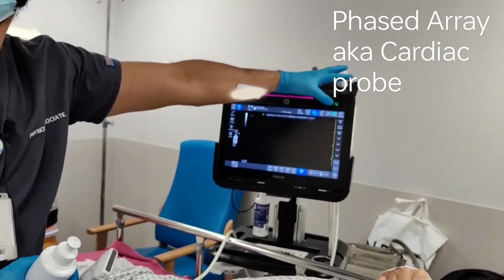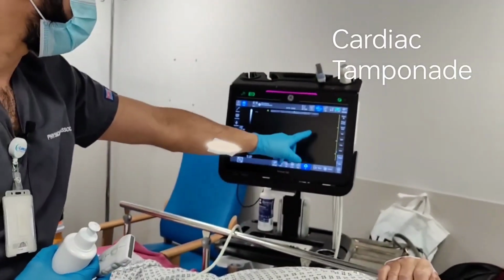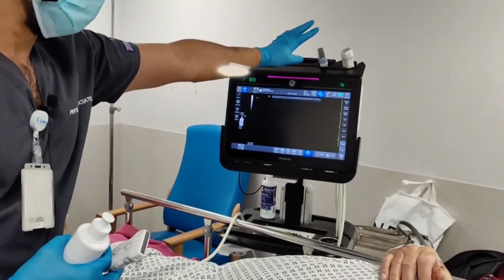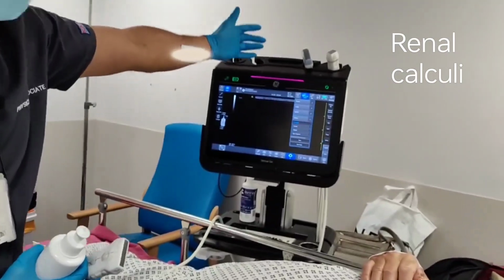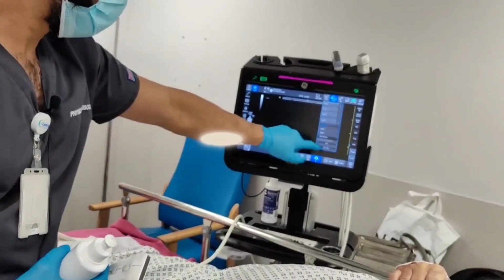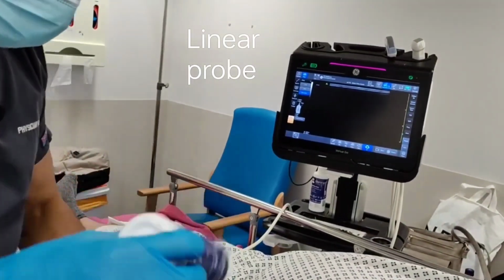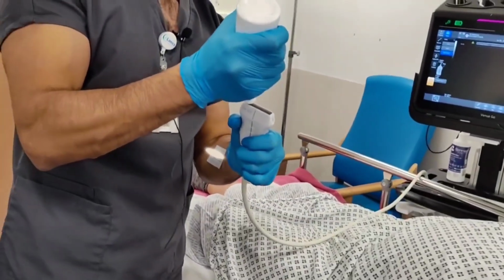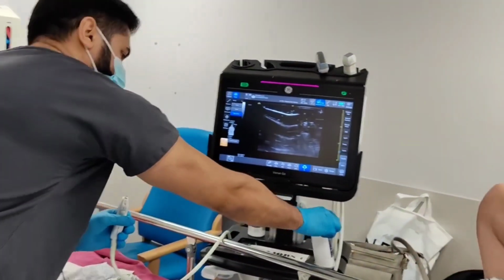So when we're doing a CPR, we pause, we're looking for tamponade as one of the 4 T's in the context of cardiac arrest. That one fast scan, so AAA, hydronephrosis, renal calculi, and the likes of these kind of situations. This probe here, usually for IV access, and what we do is we'll put some gel on there, and what you find is as I put the gel on, you see on the screen, that's given us a shadow.